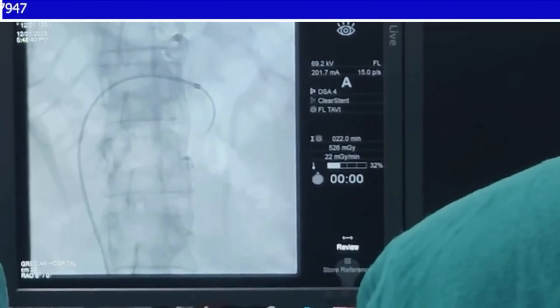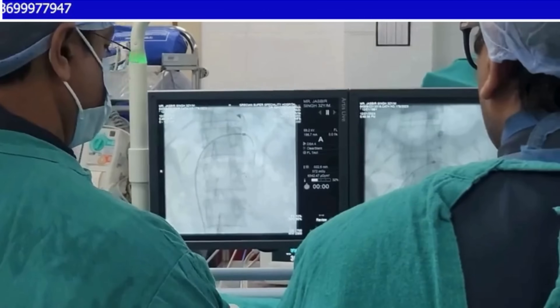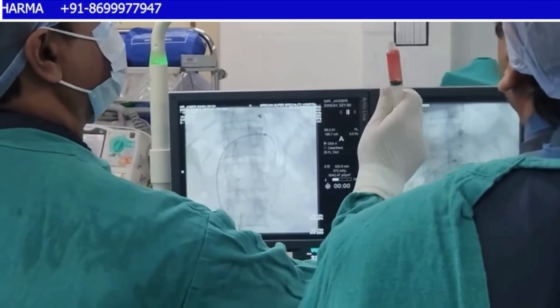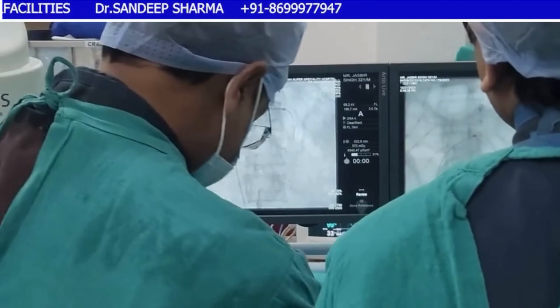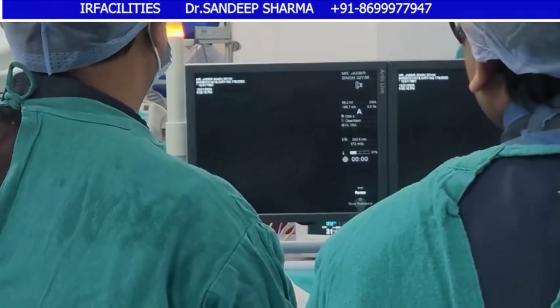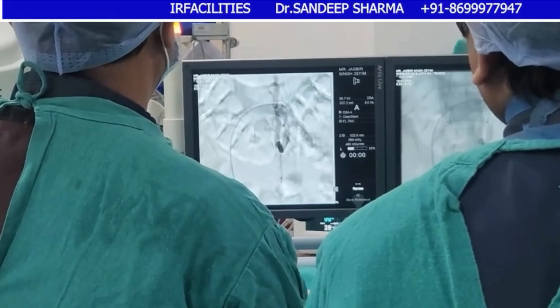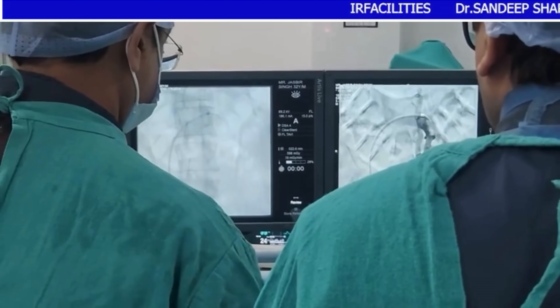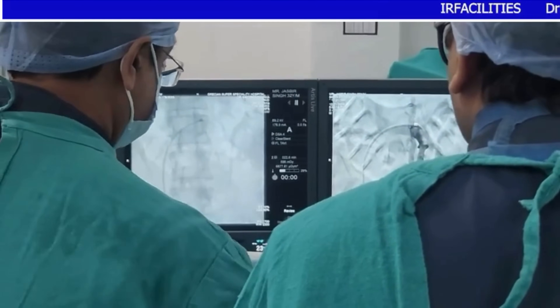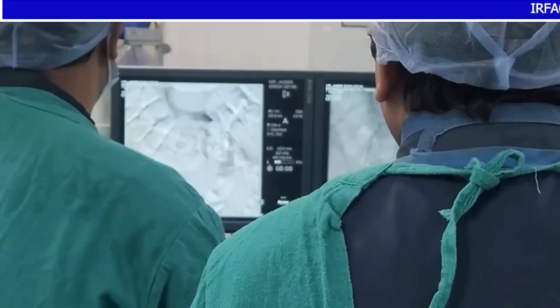I realize this must be in the azygous vein - the left paraspinal azygous vein. I explore to find the testicular vein, and when I take a strong contrast run I find all azygous - no testicular veins, no spermatic veins from there.